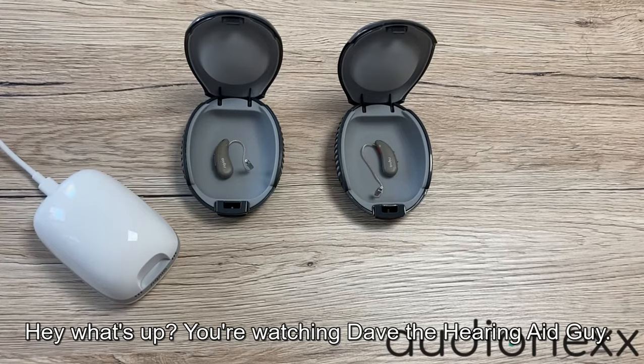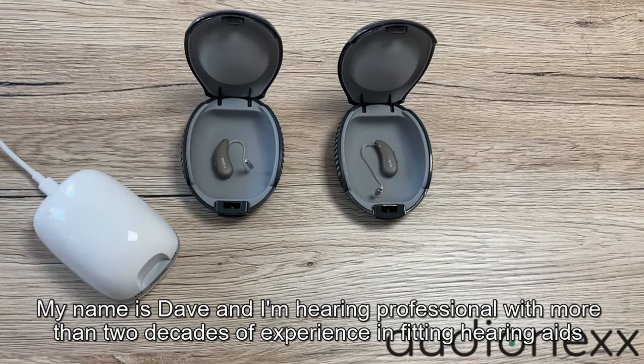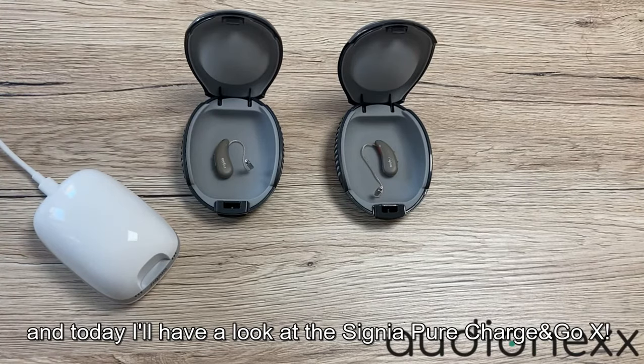Hey, what's up, you're watching Dave the Hearing Aid Guy. My name is Dave and I'm a hearing professional with more than two decades of experience in fitting hearing aids, and today I'll have a look at the Signia Pure Charge&Go X.